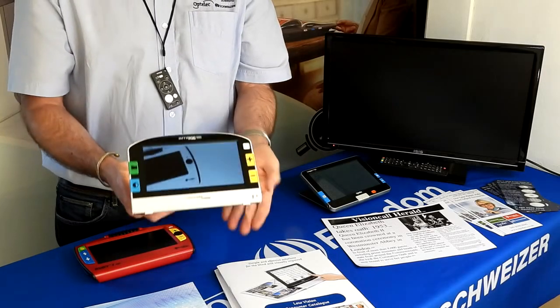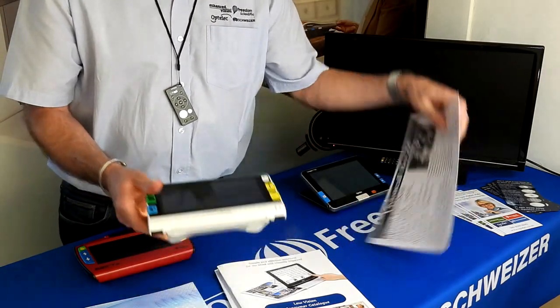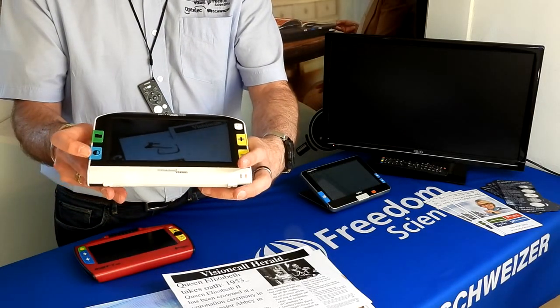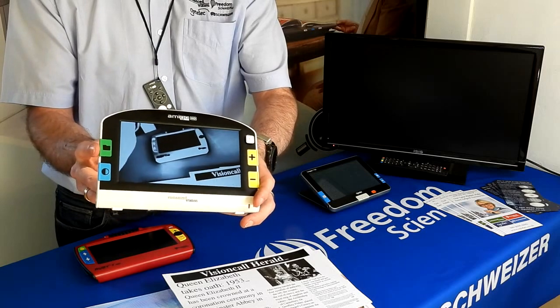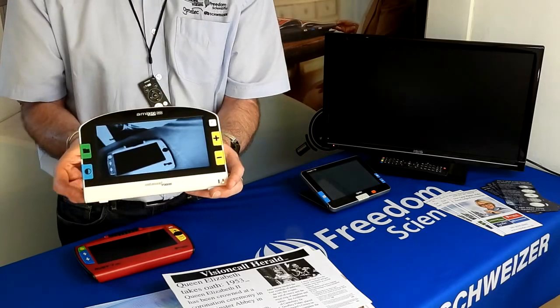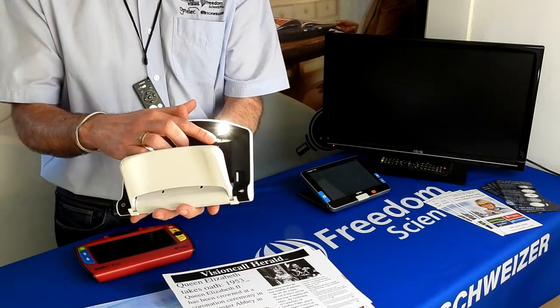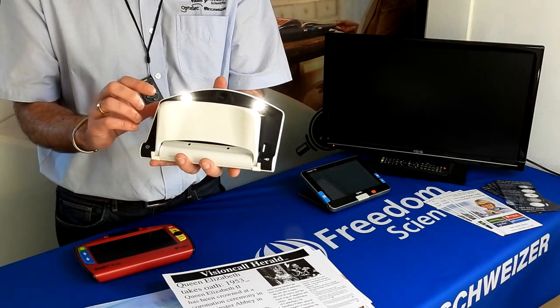Once you turn the machine on it's instant on, with LEDs built in. The button layout is very similar — large tactile plus and minus on the left side, and high contrast controls. There's also a green folder button to access your stored images, as this machine also allows you to store images. There are a couple of extra switches on the back beneath the LEDs to change from automatic to manual focus and a multi-function save button on the other side.